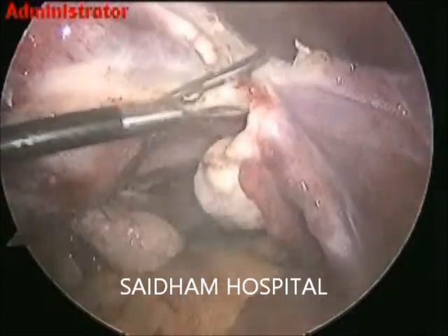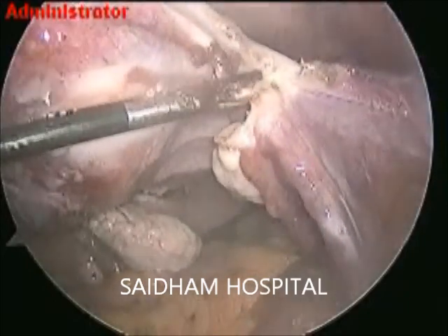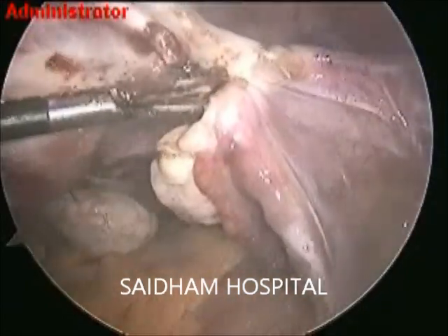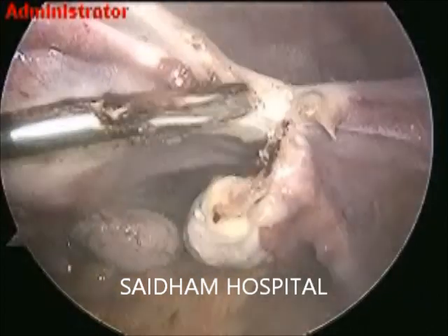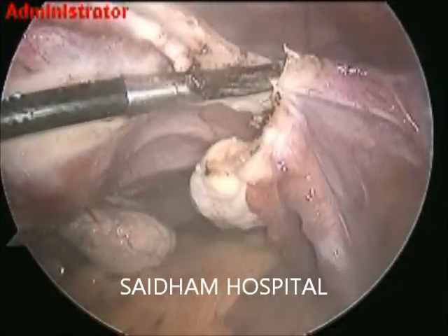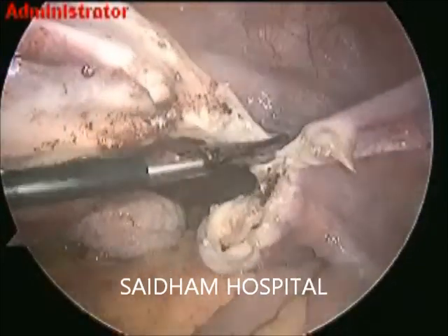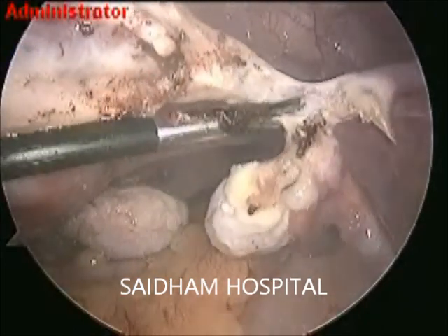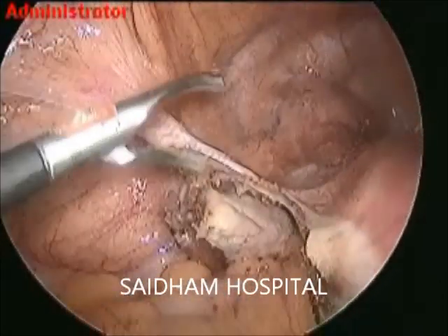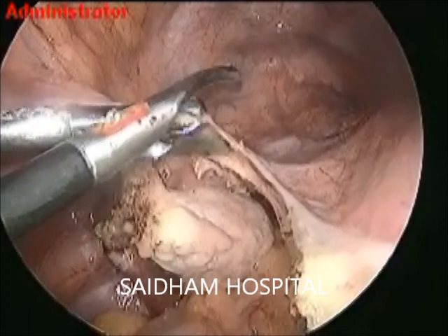In a bunch, it is coagulated. A proper coagulation is going on. The uterus is very vascular with very tough tissues due to chronic pathology. Posteriorly we see a totally fibrous POD, possibly due to fluid, hemorrhage in this patient's reproductive age group. Patient's age is near about 43 to 44. She presented with pain in the abdomen, chronic pelvic pain, irresistible to conservative management.